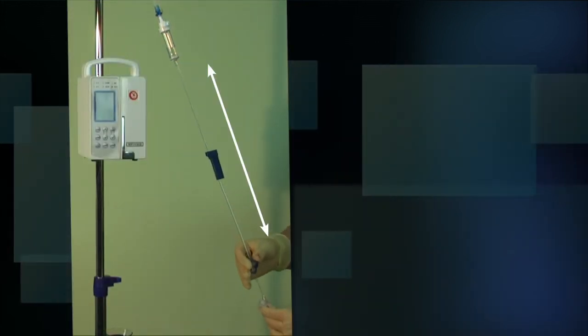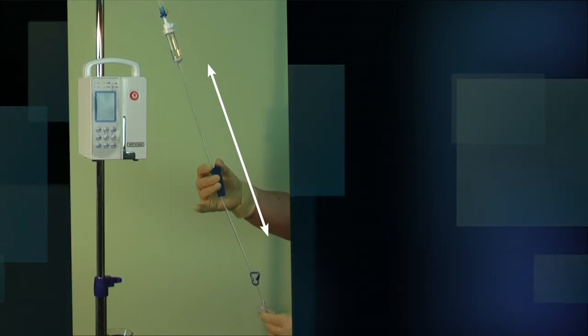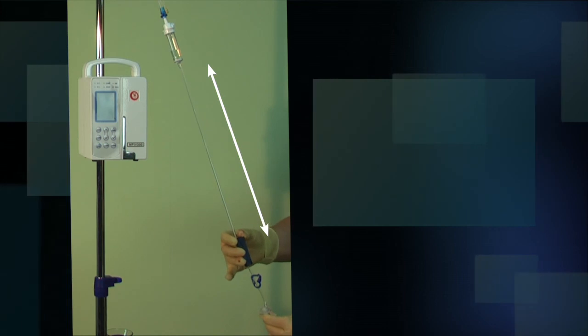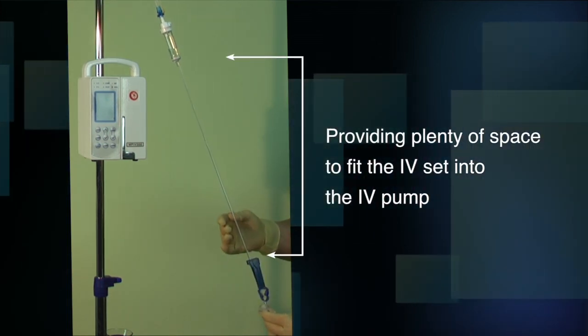The shut-off clamp and the roller clamp can easily slide up or down this part of the tubing, providing plenty of space to fit the IV set into the IV pump.